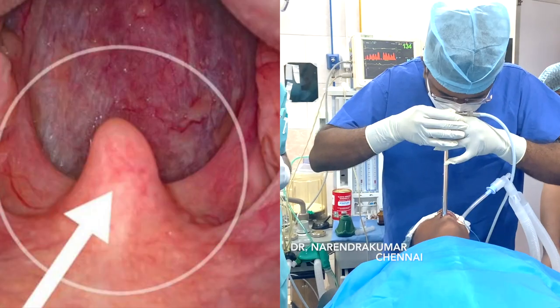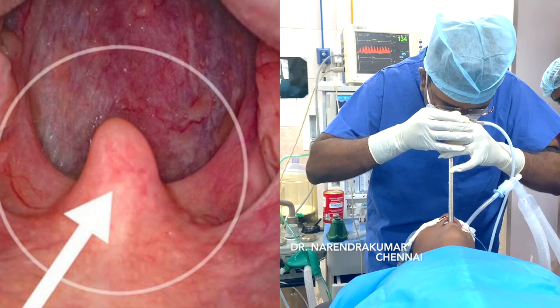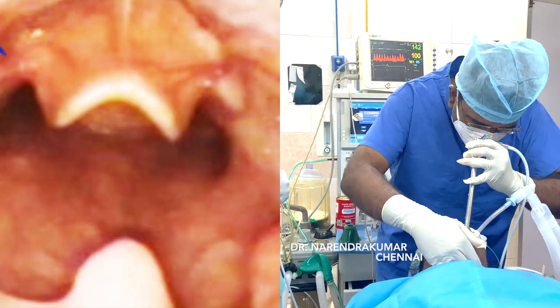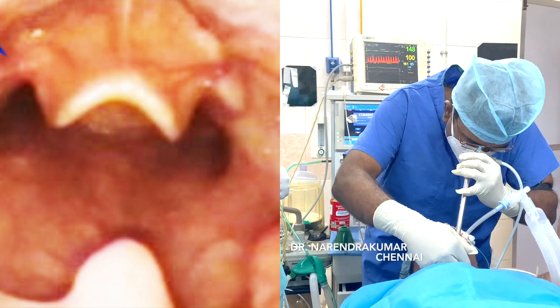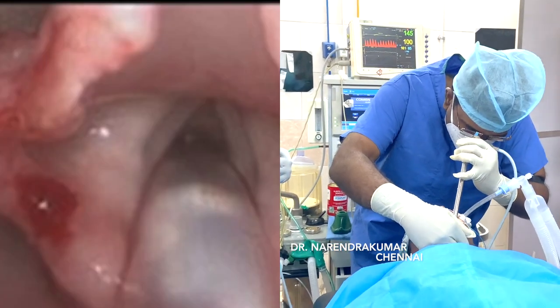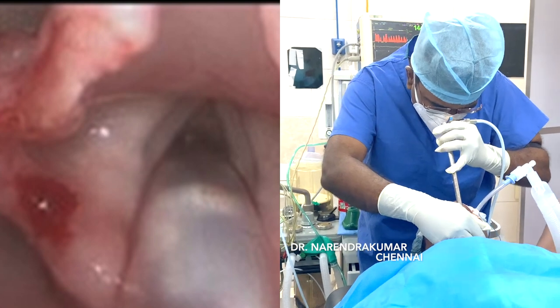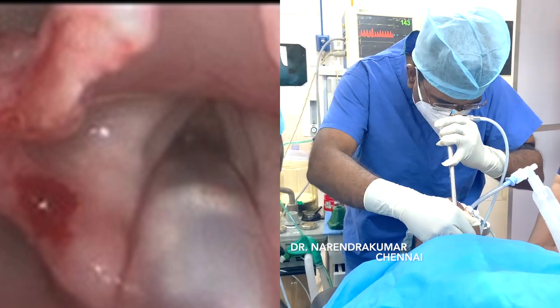First, visualize the uvula, then slowly negotiate the esophagoscope inside to see the epiglottis. After that, gently push further to capture the vocal cords, along with the ET tube in situ. Go step by step, visualizing each structure.